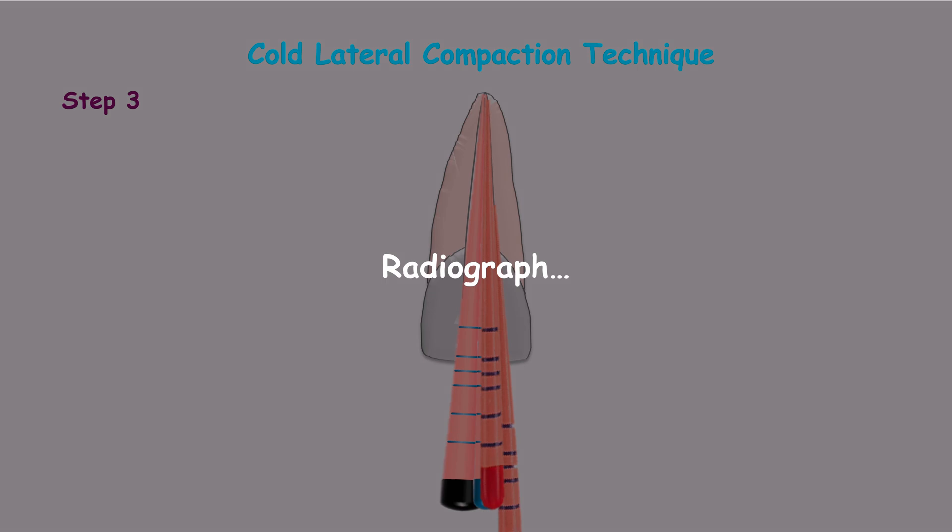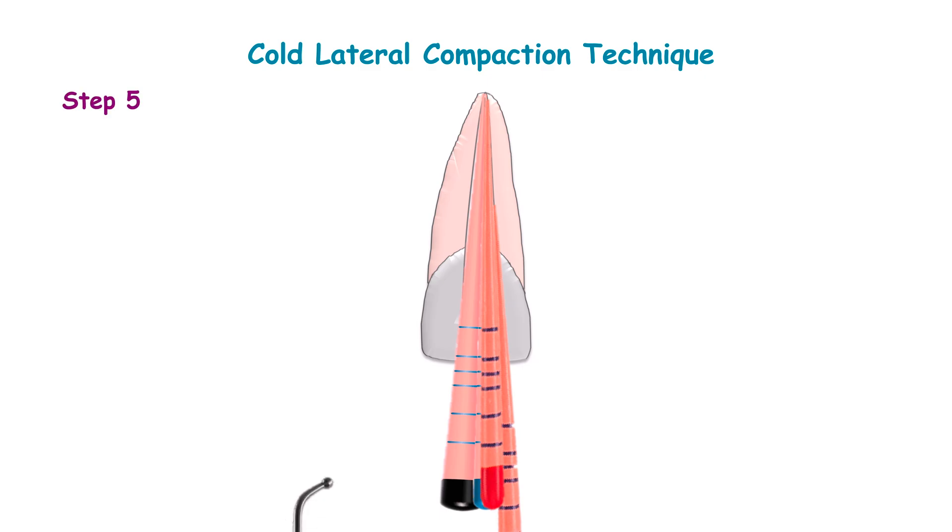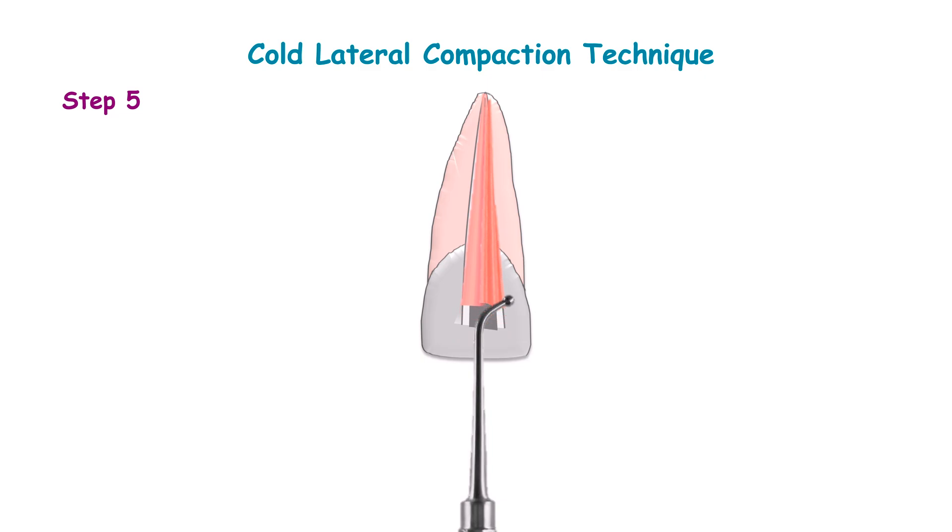A radiograph is taken to confirm the complete obturation of the radicular pulp space. Use a heated instrument to cut the gutta-percha visible coronally, then place a temporary filling.